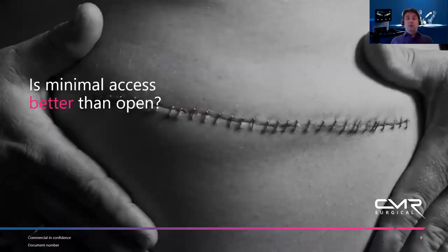So why do we need robotic surgery? Well, we believe that minimally invasive surgery, minimal access surgery, is better than open surgery for lots of reasons. But here is a typical example of a large incision so that the surgeon can get through the skin, the subcutaneous tissue and fat, through the muscle and get access so that they can get both their hands into the operating space.